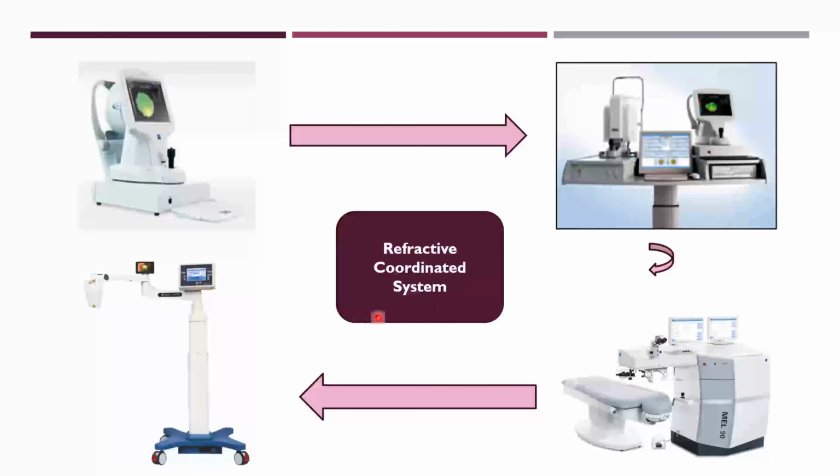Following this, the patient is immediately taken up for corneal collagen cross-linking, where depending on the residual stromal bed thickness, hypotonic or isotonic riboflavin solution is instilled for 30 minutes at an interval of every 2 minutes. And then the patient is exposed to UVA radiation of 365 nanometers at 9 milliwatts per centimeter square for 10 minutes, following which a BCL is applied and the patient is advised post-operative drops.